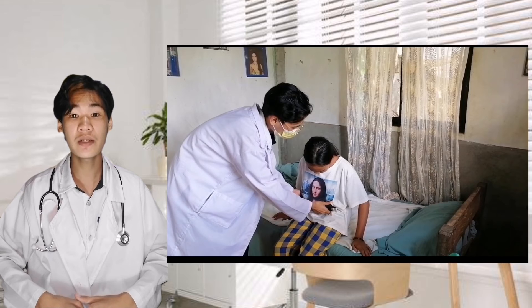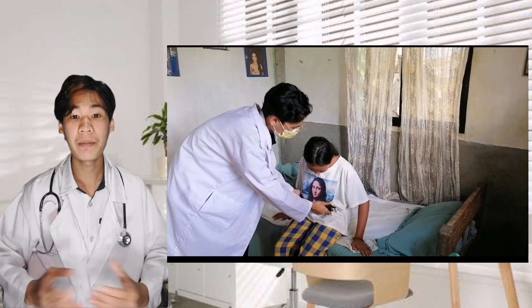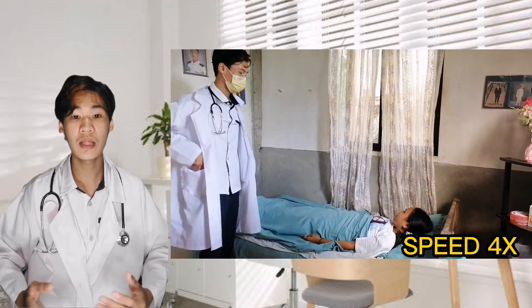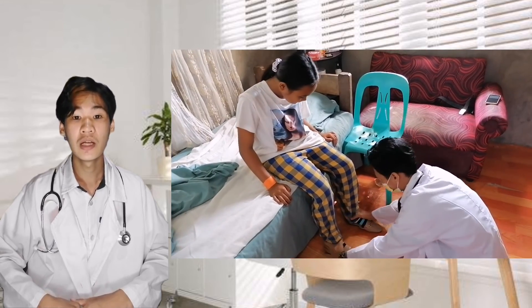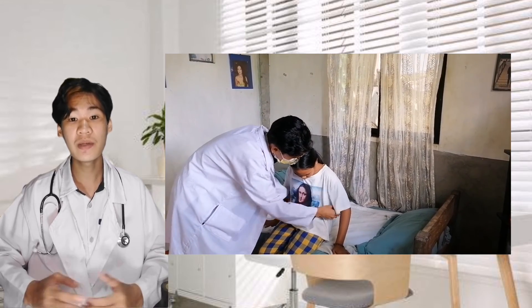A note of caution: if the person is rushed through this step or not allowed to rest at all, she may become dizzy and fall while attempting to stand. Allow her to sit for several minutes before proceeding. Observe the person for signs of dizziness or fainting as you position yourself in front of her, so you can offer assistance in case she loses balance. Ask the person if she feels dizzy or faint; if she does, assist her back to a supine position. Next, help the person put on her shoes or slippers. Make sure clothing doesn't interfere with the transfer. When the person is ready, apply the transfer belt around their waist over all clothing. Buckle the belt in front, then turn it so the buckle is off-center. Tighten the belt and check for fit — it should be snug, but you should be able to slip your fingers between it and the person's waist.